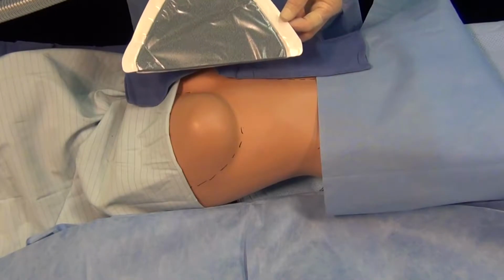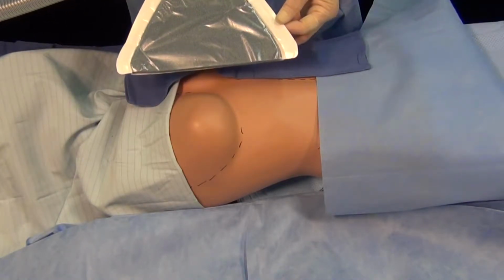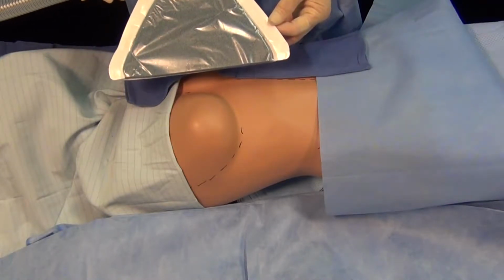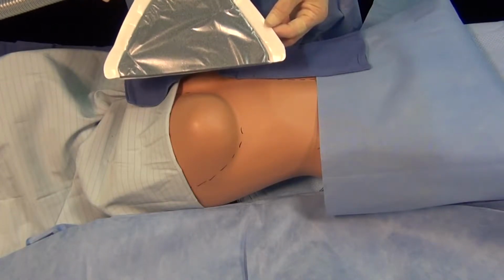Probably one of the trickiest procedures to try to apply the miniSQUAIR to is with mastectomy. And the important thing to remember is that it's the strength of the suction and the movement of the amount of airflow that will carry the smoke to the collection device.